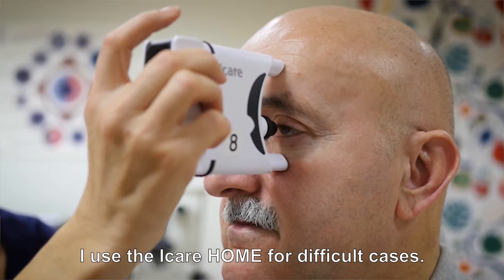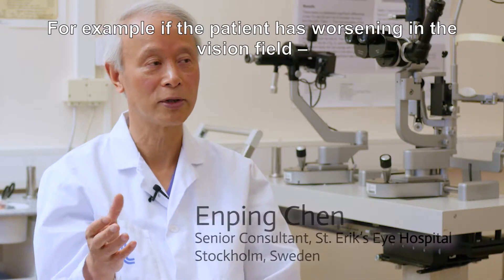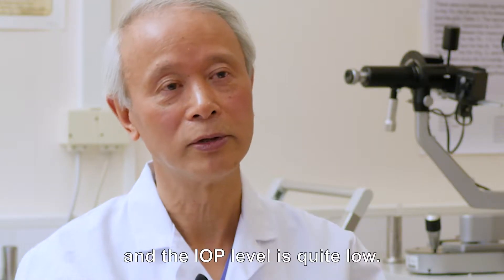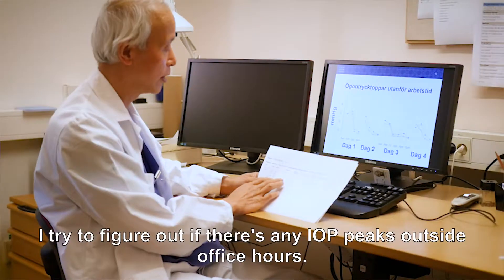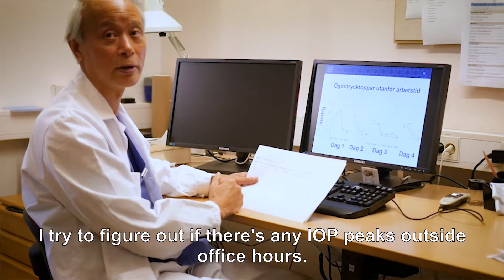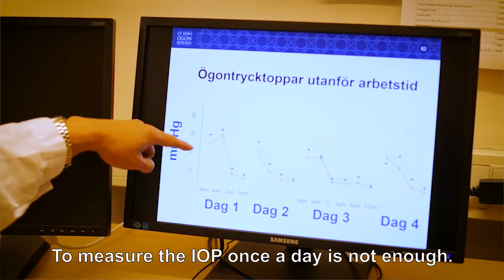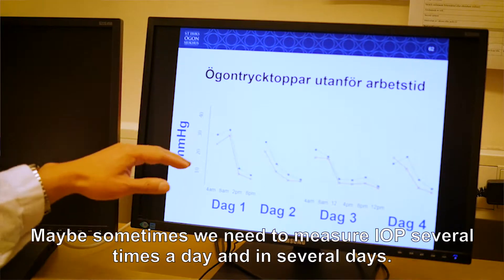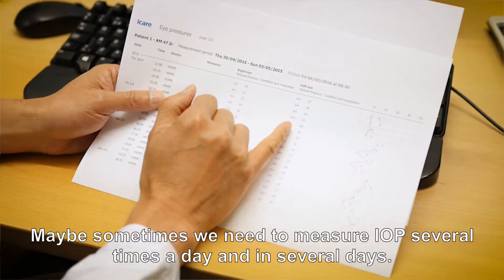I use the iCare Home for difficult cases. For example, if the patient has a visual field worsening and the IOP level is quite low, I try to figure out if there's any IOP peak outside office hours. Making IOP measurements once a day is not enough — sometimes we need to measure IOP several times a day and over several days.